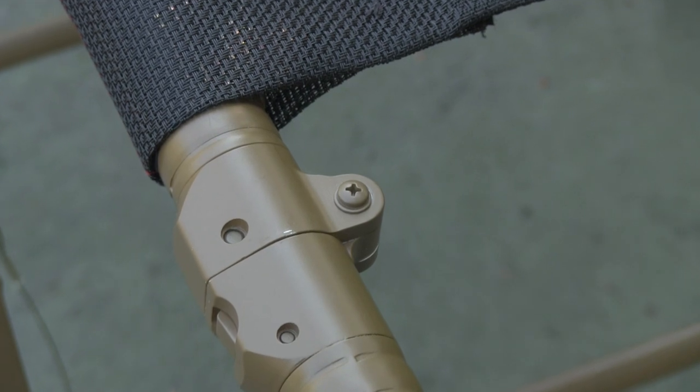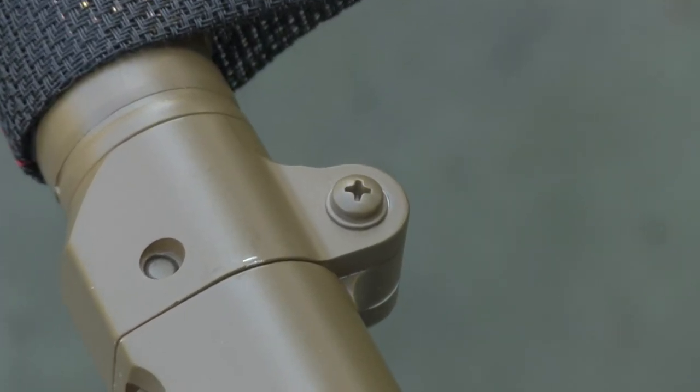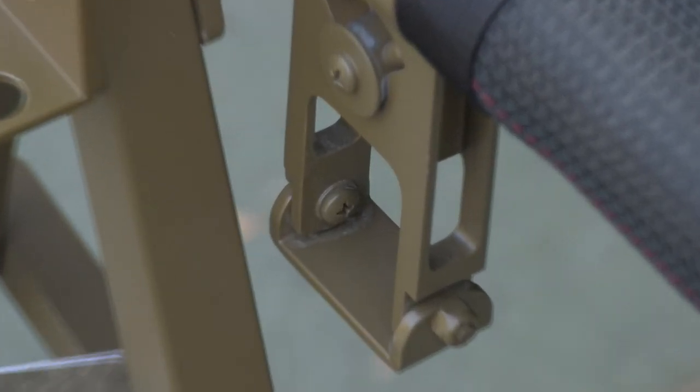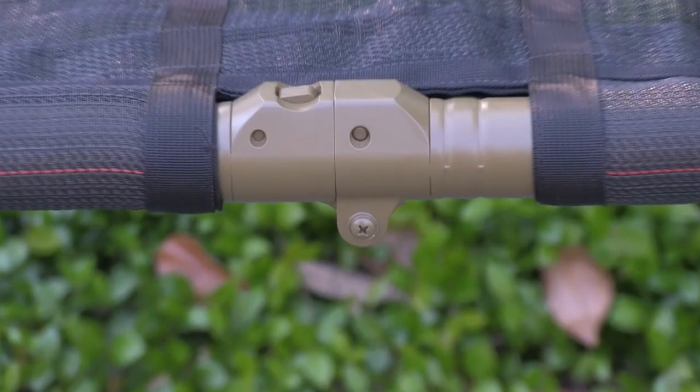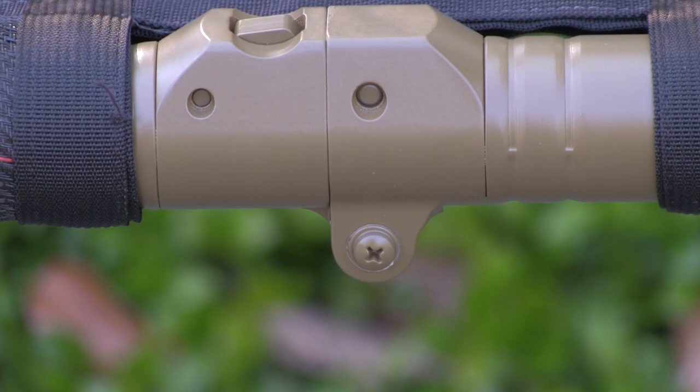The litter handles, feet, and frame sections are field replaceable with a Phillips head screwdriver and open end wrench, allowing deployed personnel to cannibalize damaged litters for parts to keep other units in service. Repair parts kits are available from the manufacturer, allowing for user level repair.